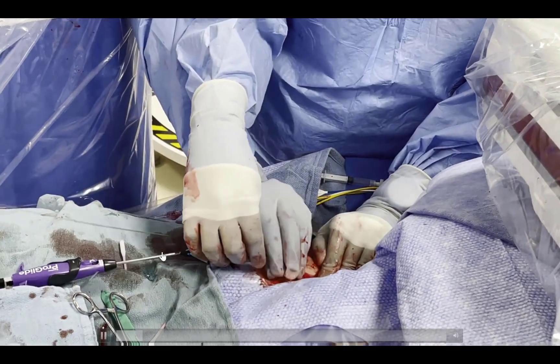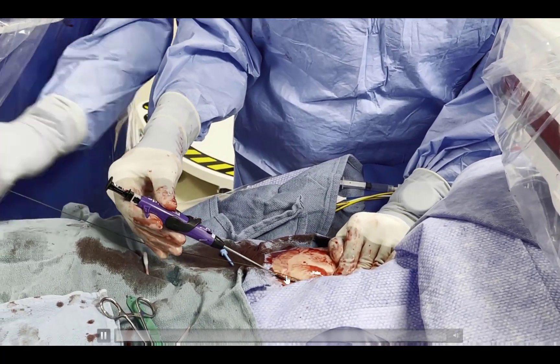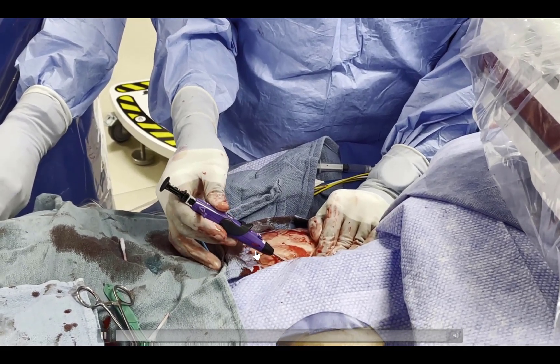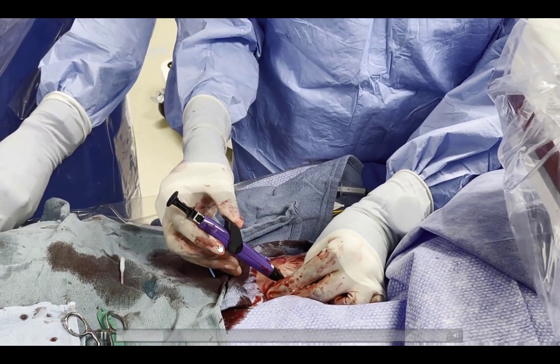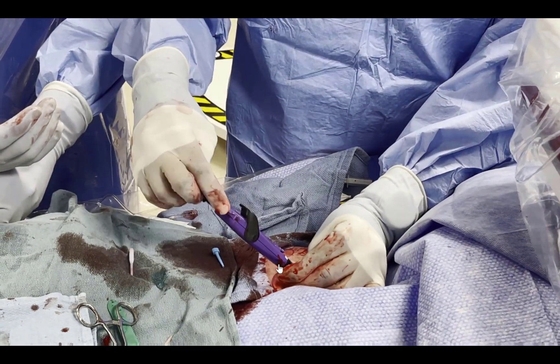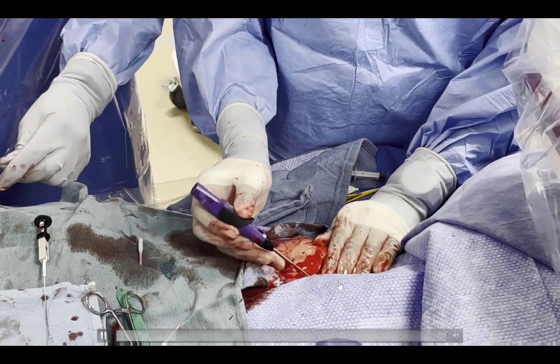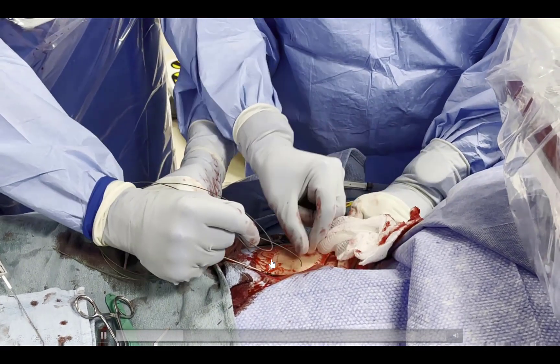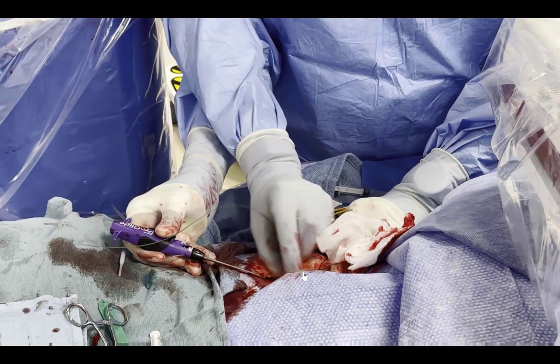After this is done, a per-close device is inserted into the arteriotomy. We remove the 0.035 guide wire first, then with a slight forward motion the device is inserted — we now have good blood flow. We rotate the device slightly clockwise to approximately 10 o'clock, pull the foot back, pull the device against the artery wall, and deploy the first suture. We then remove the needles, cut the suture, pull the foot down, remove the device, and use the port of the per-close device to reinsert the 0.035 or 0.038 guide wire into the femoral artery, maintaining access into the vessel.